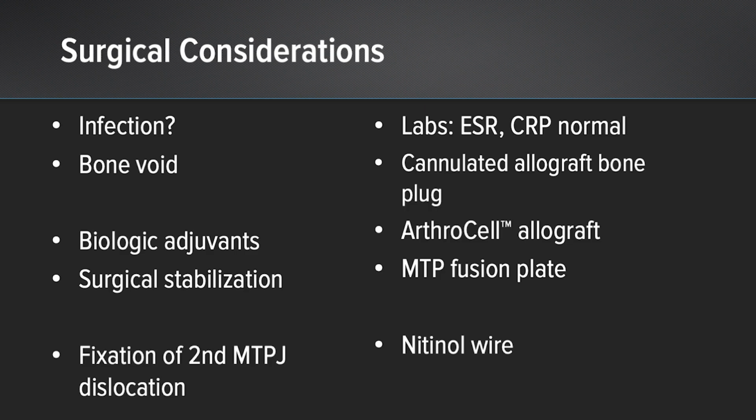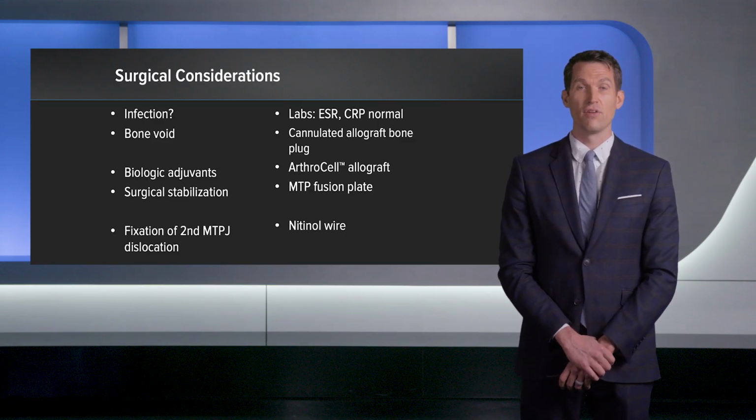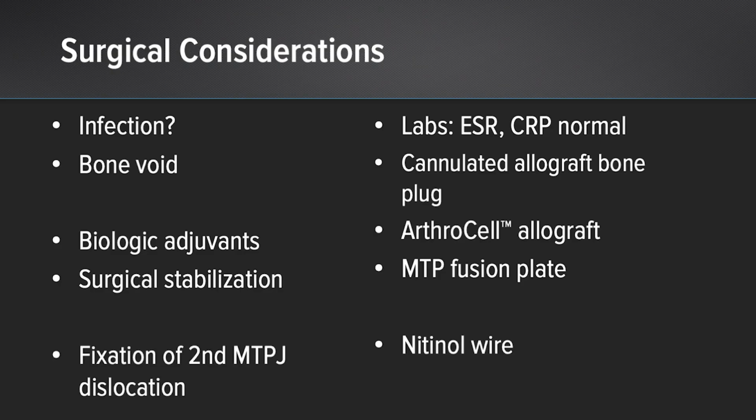Surgical considerations for this case: infection. Labs such as ESR and CRP were all normal, and there was no clinical indication of infection. The large bone void needs to be considered. For that, the solution of a cannulated allograft bone plug was on hand in the operating room to fill the bone void left by the arthroplasty. Biologic adjuvants considered, such as ArthroCell and PRP.